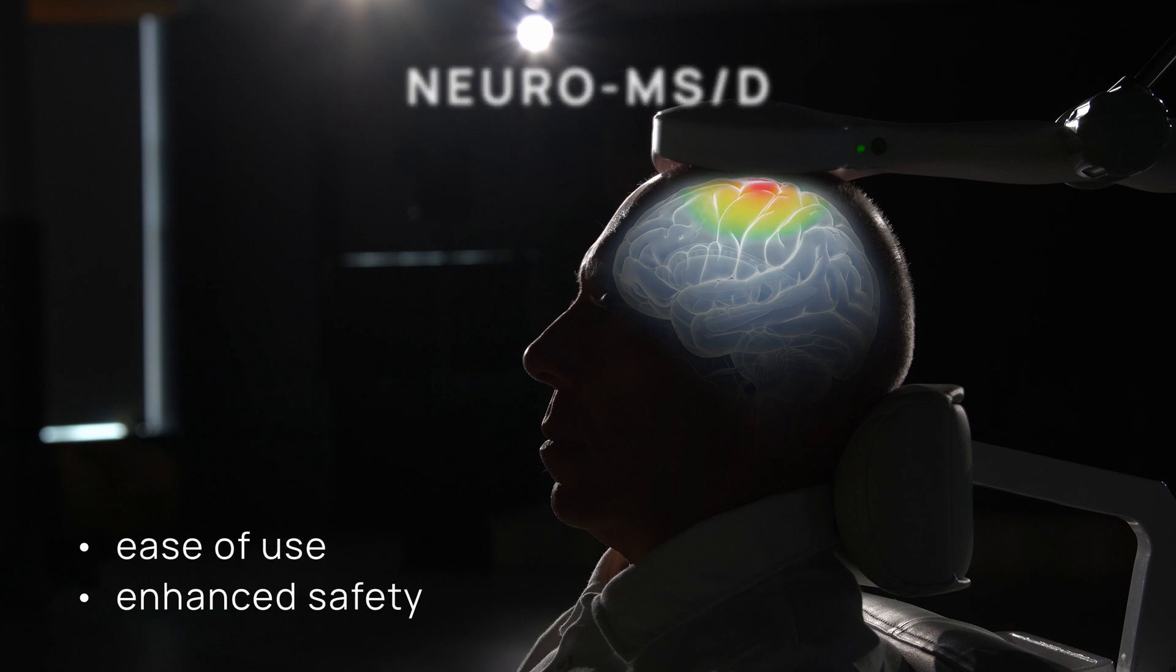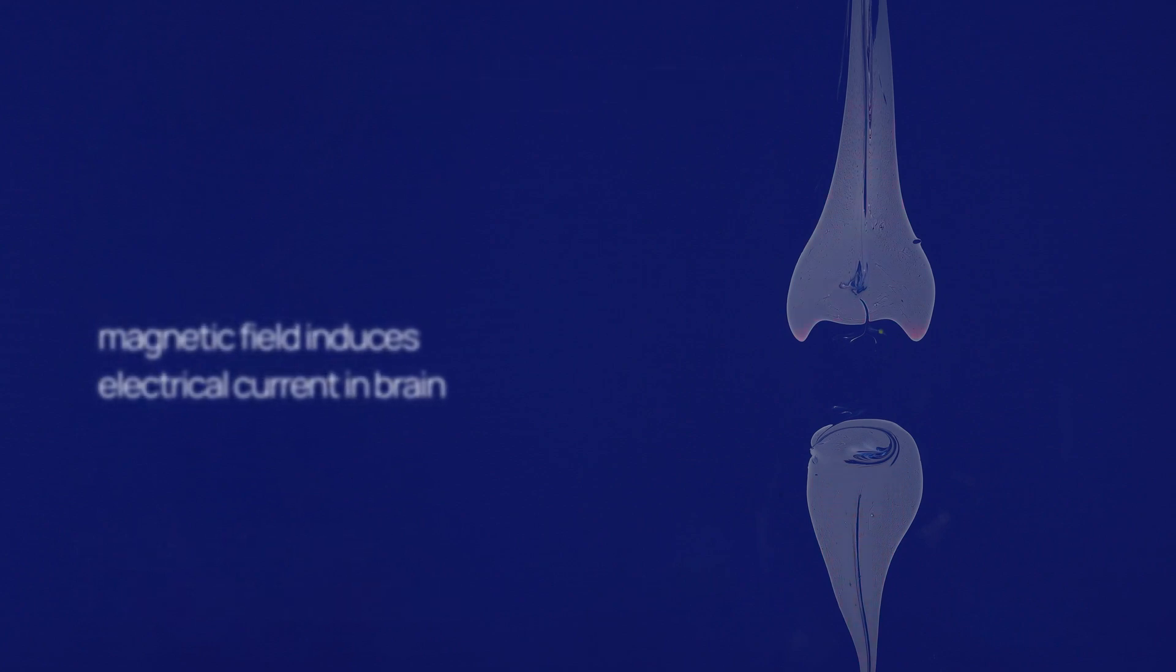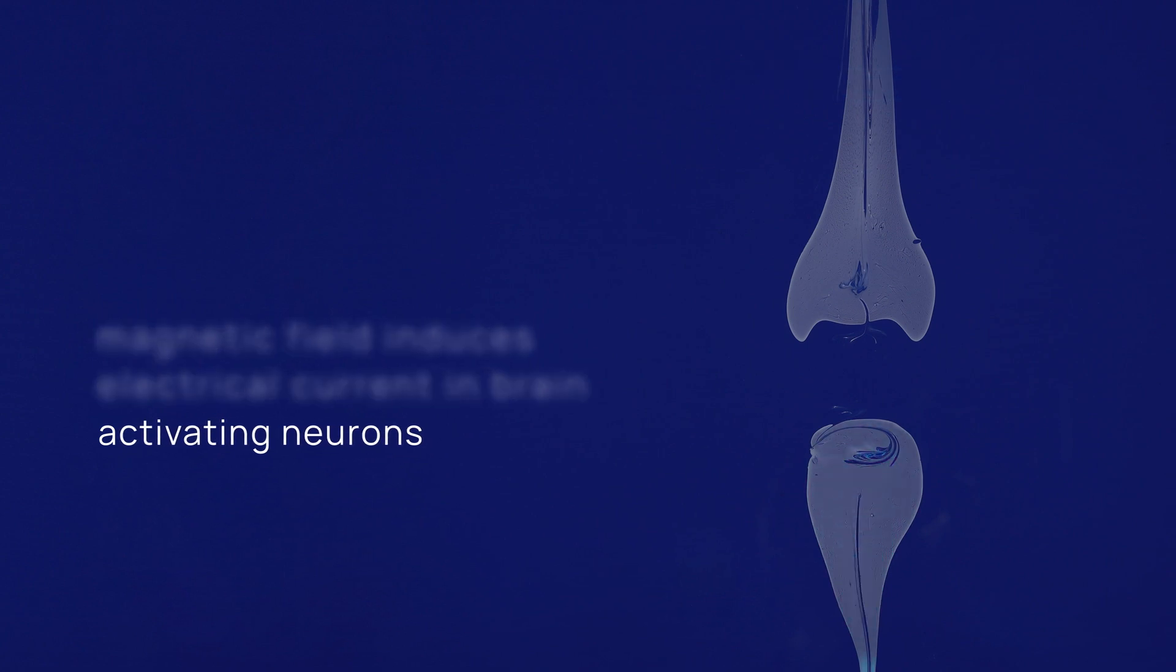During a TMS session, a magnetic coil is positioned against the scalp near the forehead. Brief magnetic pulses delivered by the system specifically target the affected areas of the brain.